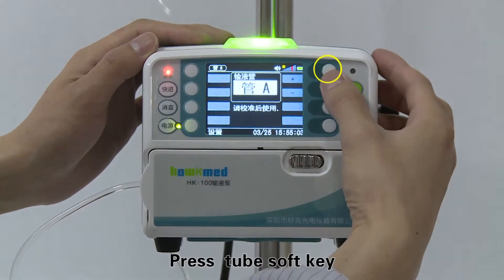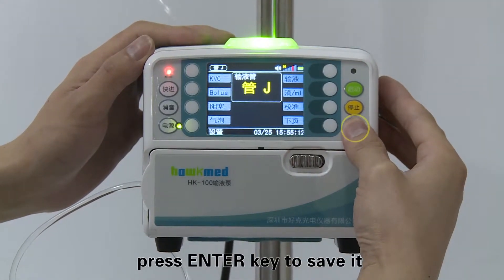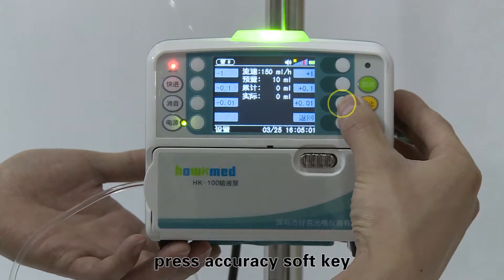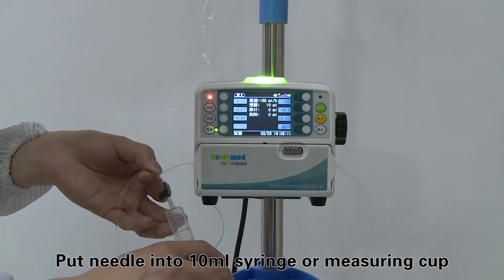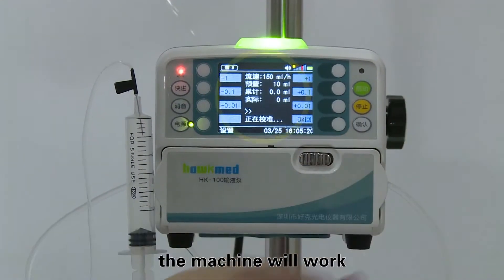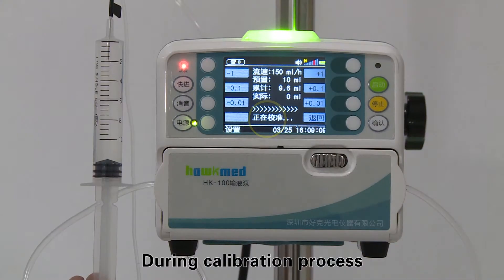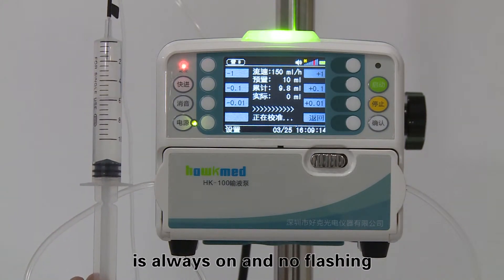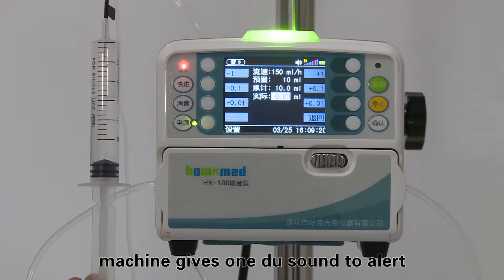Press the tube soft key, then press the plus or minus key to choose the type of infusion set, and press enter to save. Step three: after choosing the type of infusion set, press the accuracy soft key to enter the accuracy calibration interface. Put the needle into a 10 mL syringe or measuring cup, then press the start key. The machine will work at 150 mL per hour with a volume limit of 10 mL. During calibration, the green indicator light is always on without flashing. After the 10 mL infusion finishes, the machine gives one beep sound to alert.